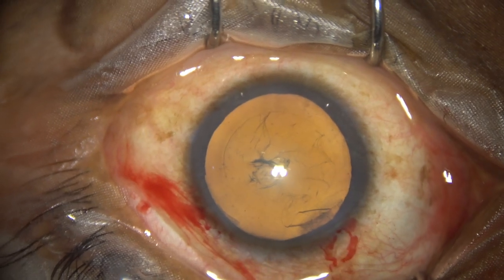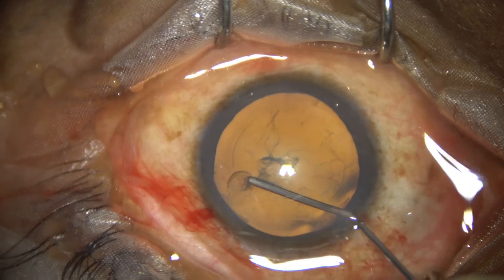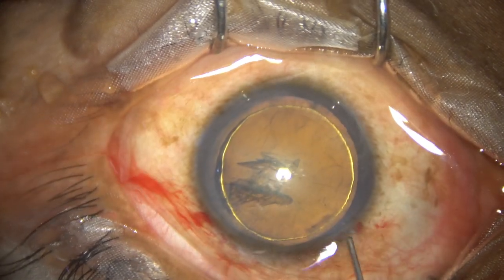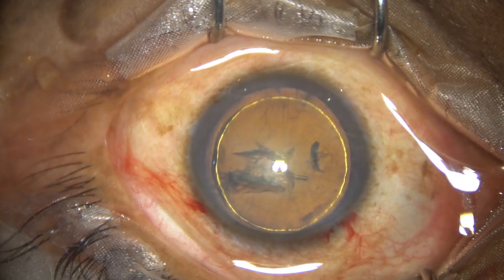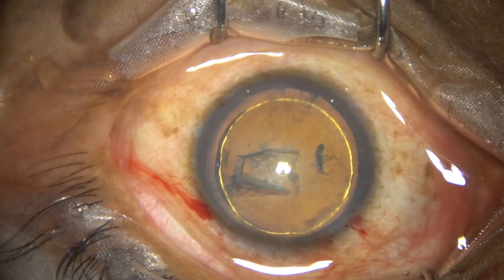Now hydrodissection is done with a 27-gauge cannula after expressing out some viscoelastic. Hydrodelineation is also done, and then some more viscoelastic is added.